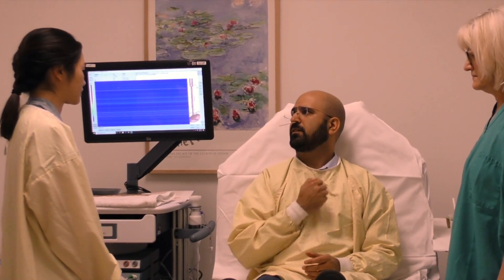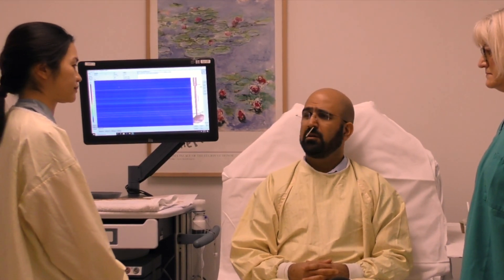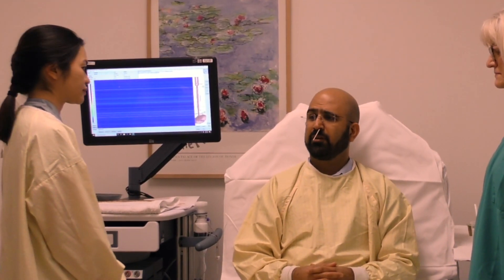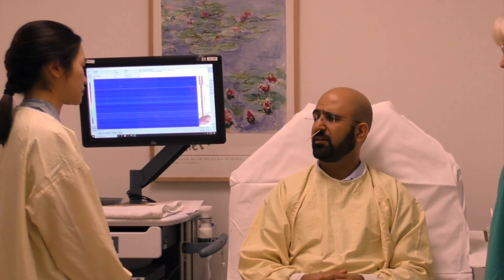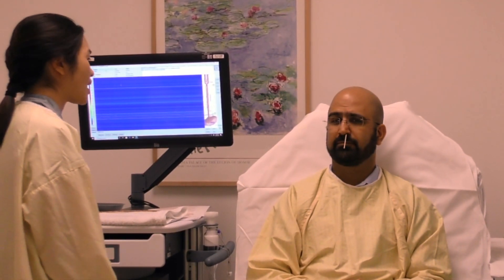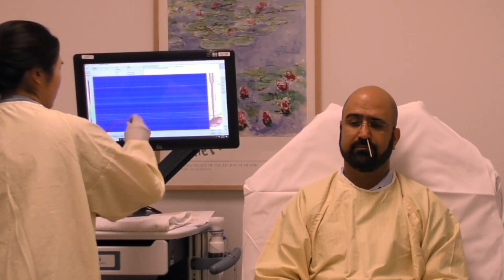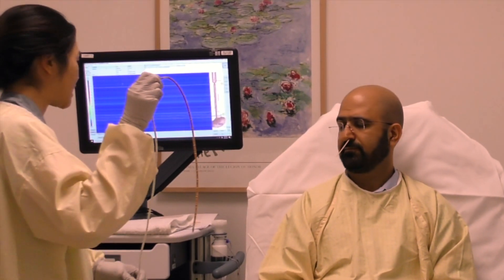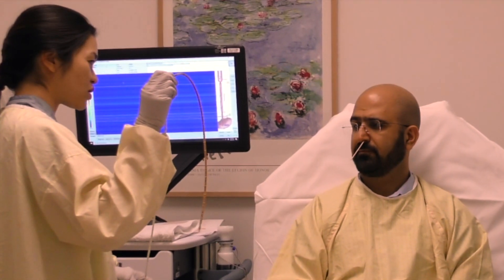Food gets stuck here. Does it hurt to swallow, or do you feel like there's a lump in your throat? No, but I've had reflux and indigestion for the last three years. I've been on heartburn medications for one year, but they have stopped working. Well, this test is called high-resolution esophageal manometry. This is the manometry catheter — it has sensors that measure pressures in your esophagus. Do you have any questions before we start? No.